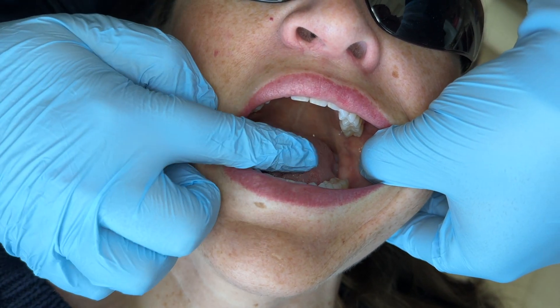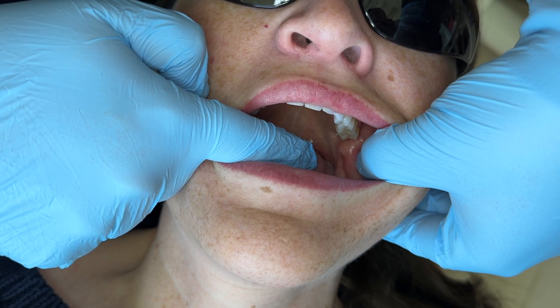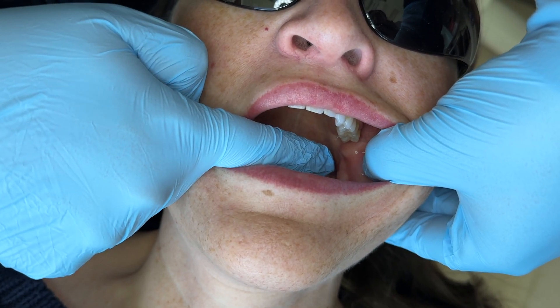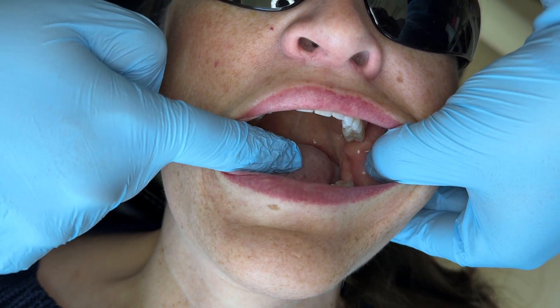Another way you can do it — if you're having a hard time or the tongue's in the way — you can actually have that cheek relax, and I can push a little bit with this cheek tissue and I can see that little line indent right back there where I would have my needle.